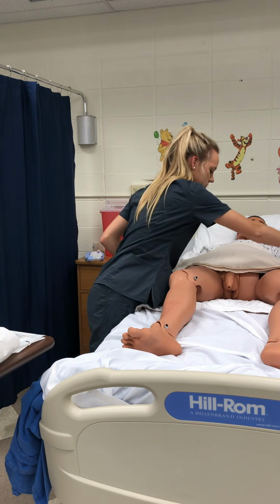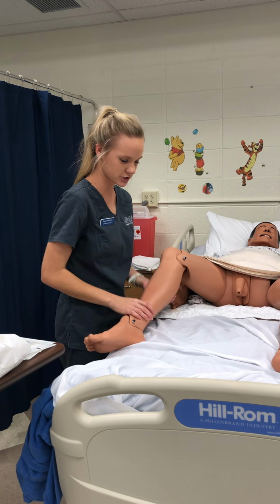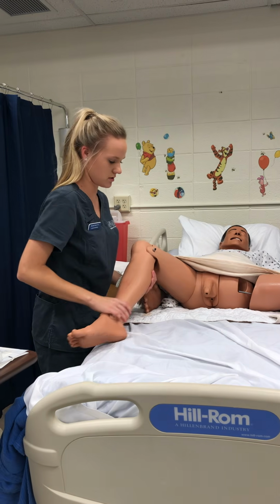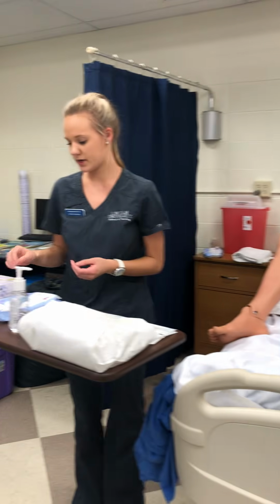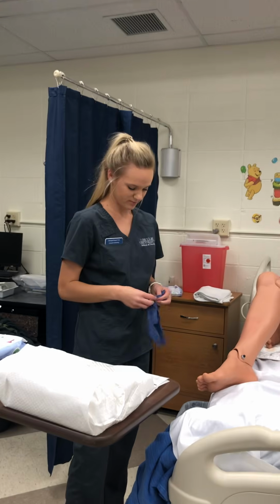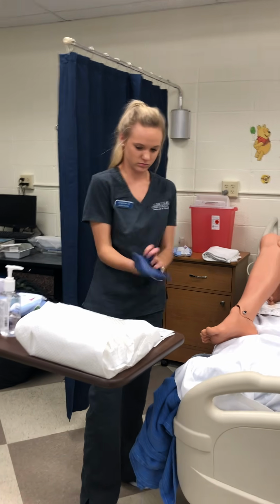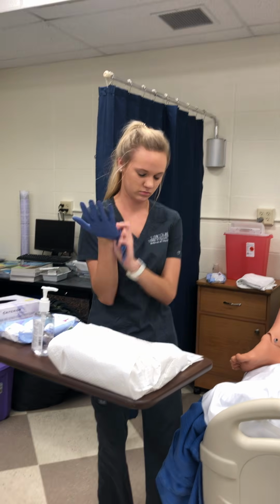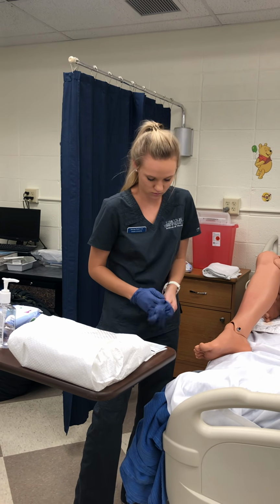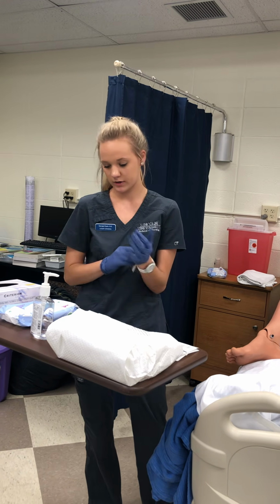Okay, so I'm going to go ahead and put him in the frog leg position. Okay, now I'm going to go ahead and put on my clean gloves. I'm going to go ahead and do perineal care.